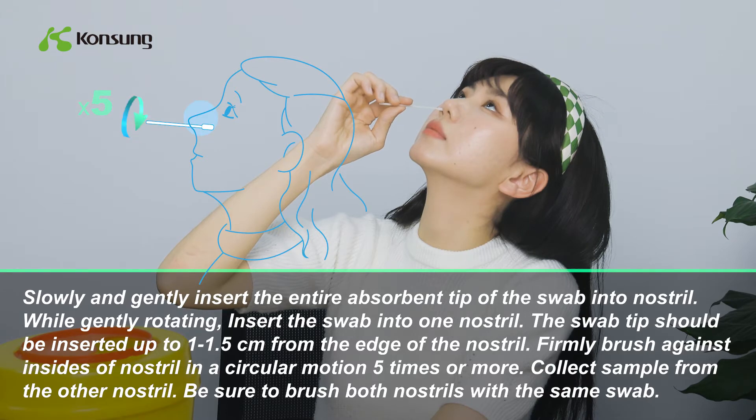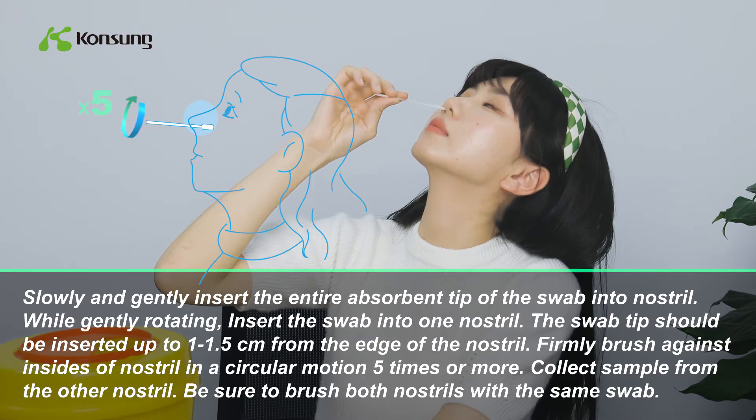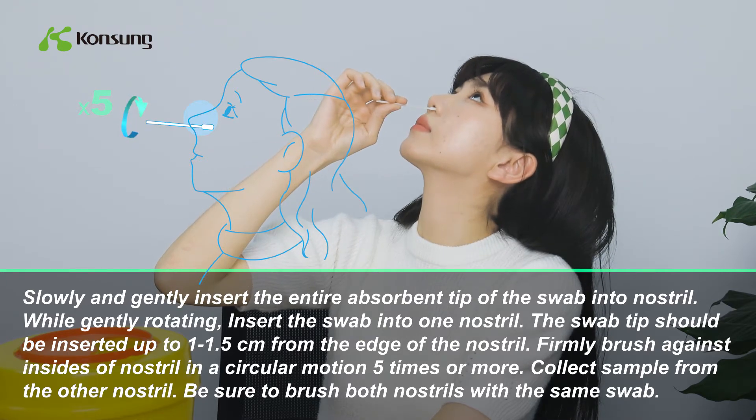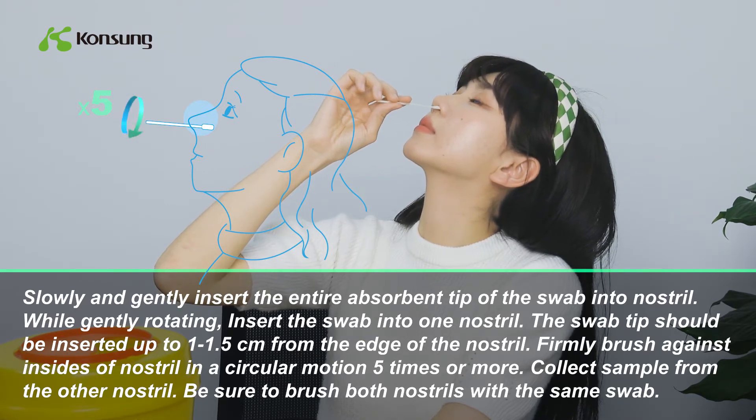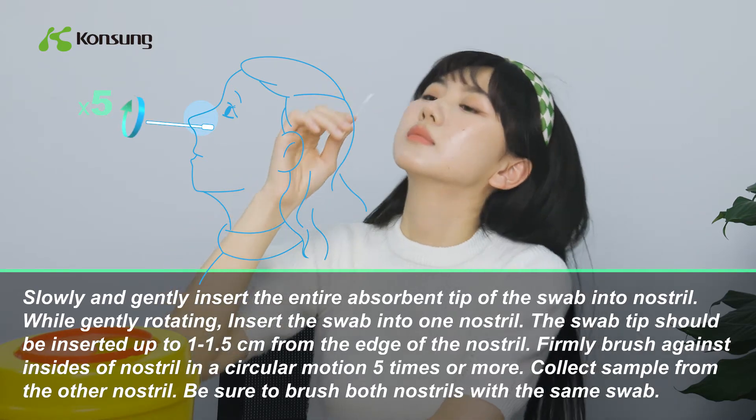The swab tip should be inserted up to 1 to 1.5 cm from the edge of the nostril. Firmly brush the inside of the nostril in a circular motion 5 times or more. Collect sample from the other nostril, making sure to brush both nostrils with the same swab.